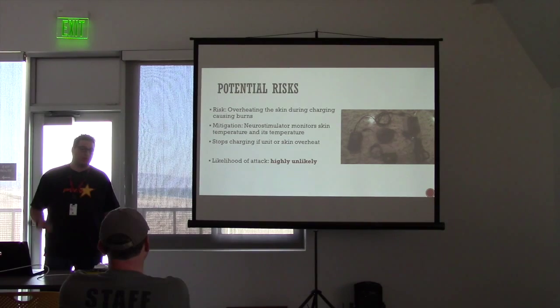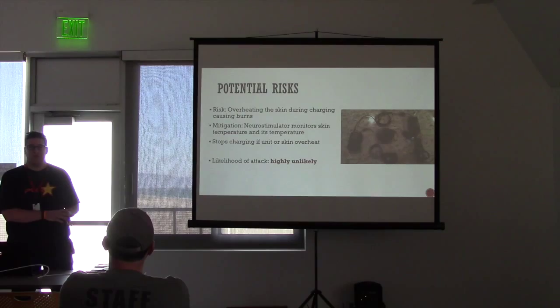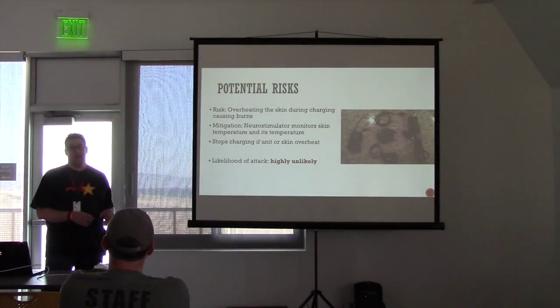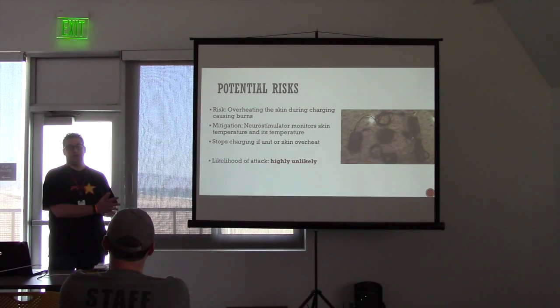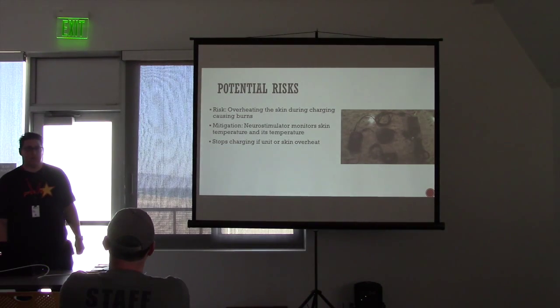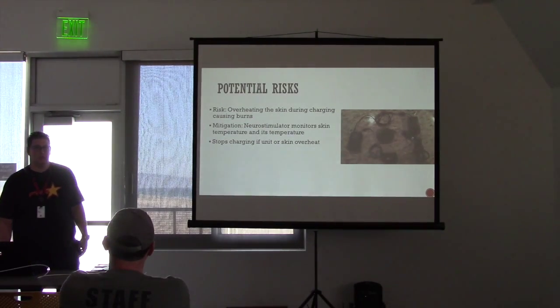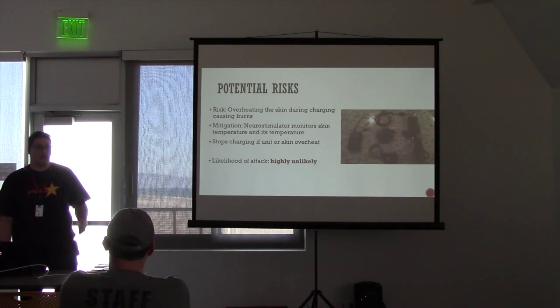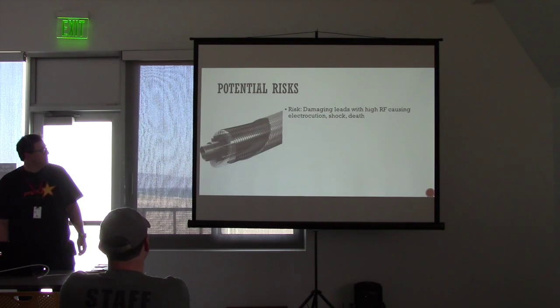Okay. As I understand it from the documentation, as I said, I haven't reverse engineered this because it's in her back. From the documentation that's available, that magnetic connection is what allows that to be turned on. So when that breaks, it disables it. Whether there's an actual physical mechanism that gets in the way, I'm not sure. Theoretically, yes, you're right. So it's probably highly unlikely that this would happen.